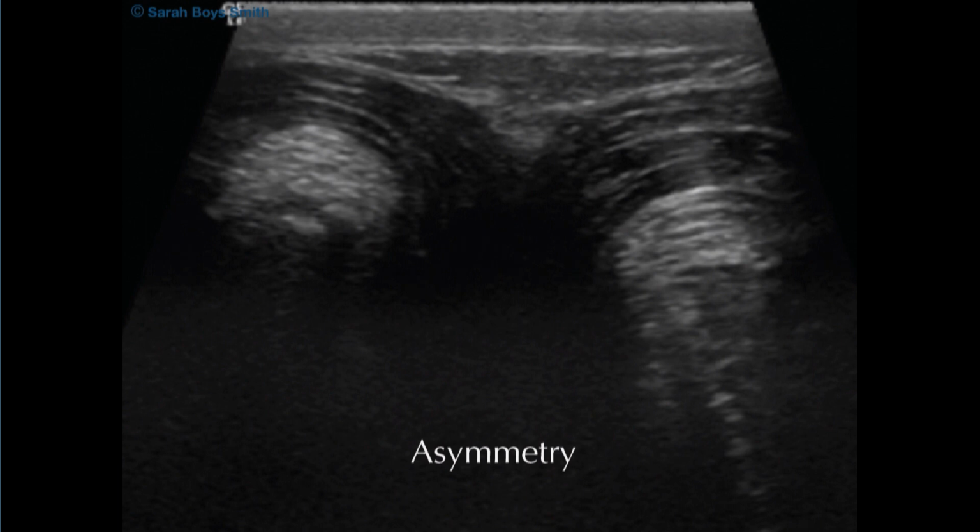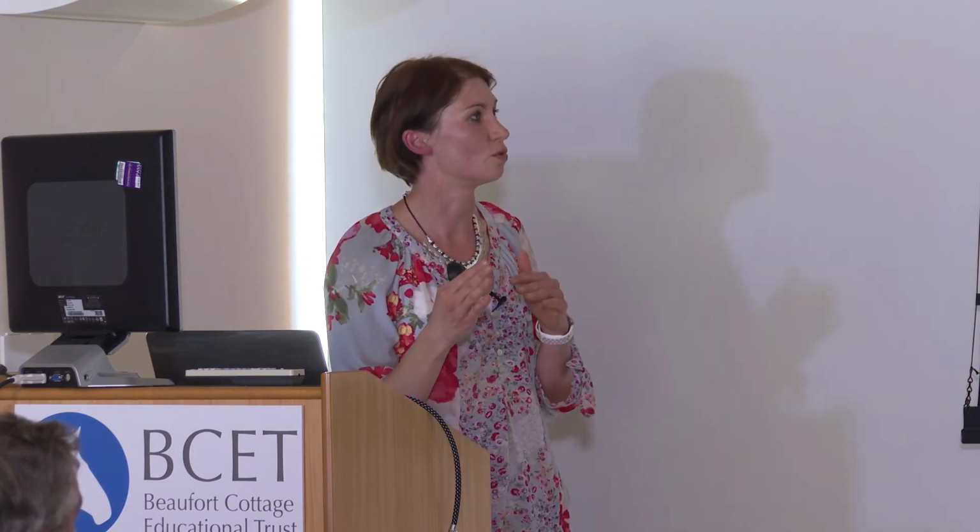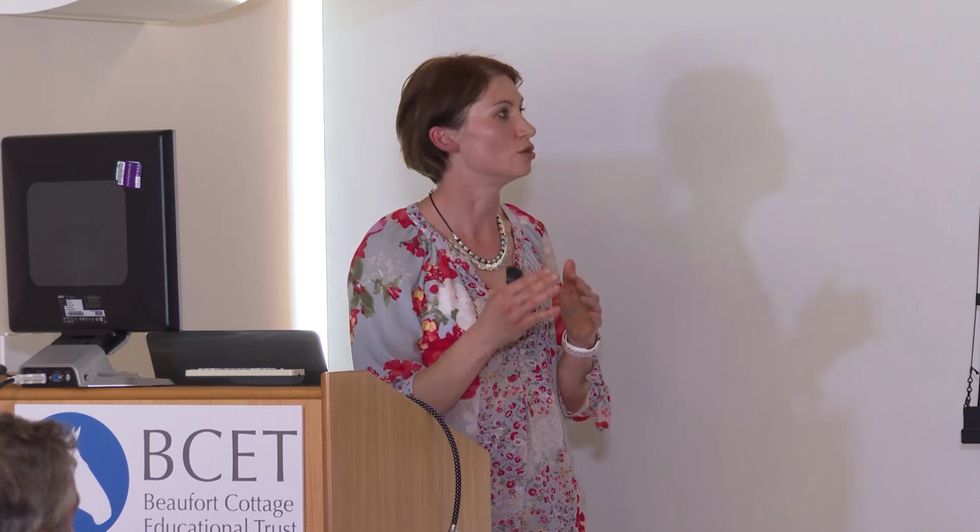It's also very easy to put more pressure on the probe on one side of your tuber sacrale and create a difference in height. So you have to be quite strict with yourself in making sure that the pressure of your probe is very even between your left and your right side, so you don't create an asymmetry that wasn't there.